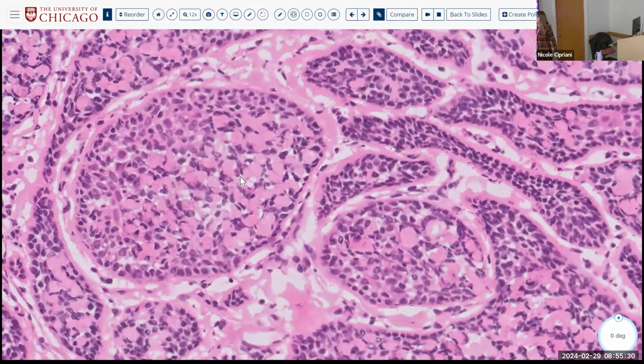In the cribriform spaces in adenoid cystic, the secretion is more bluish. It's more connective tissue mucin. If you compare, I'm happy to send out this link for the PathPresenter so you can look at these on your own. The mucin in adenoid cystic is bluish.